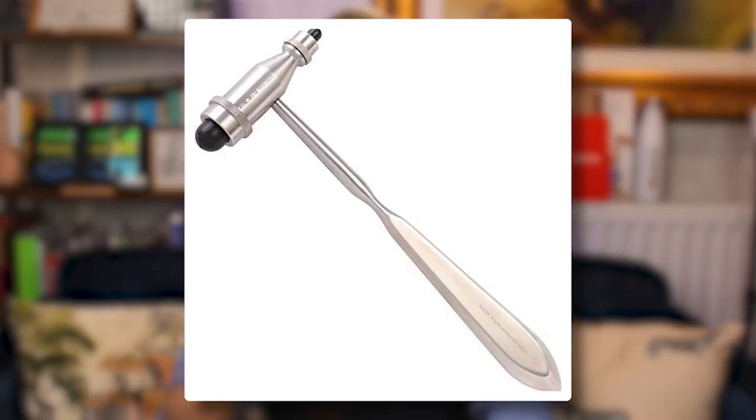Moving to a slightly different set of designs, this next one is called a Tromner hammer, and it looks much more in keeping with what you would call a hammer — a handle with a mallet-looking thing at the end. You'll notice that it has two different heads with different sizes, because they're designed to do different things. The larger head is used to elicit the neurological reflexes we've already talked about, while the smaller head is used for eliciting something called percussion myotonia.